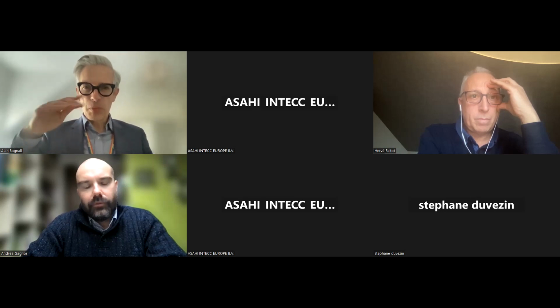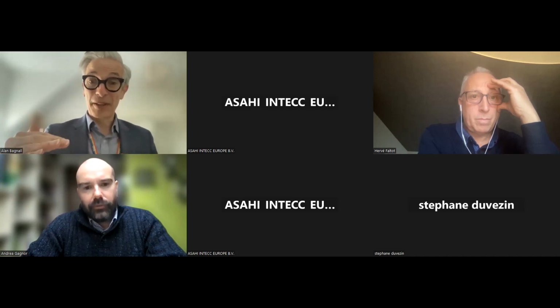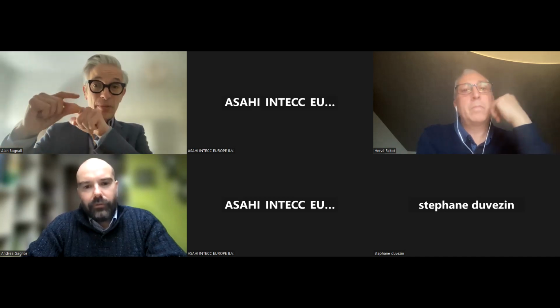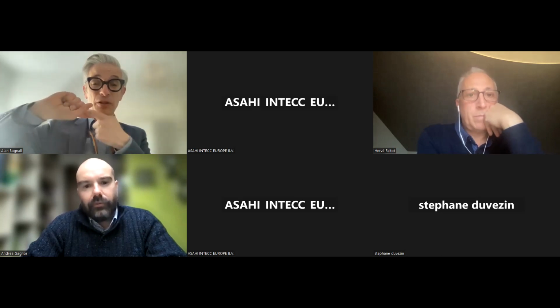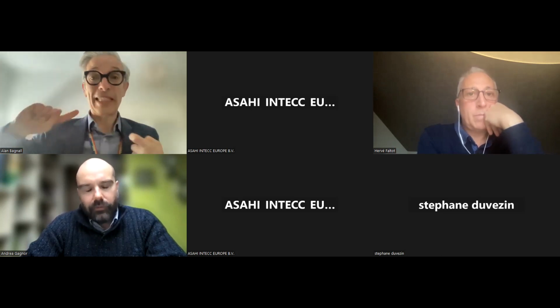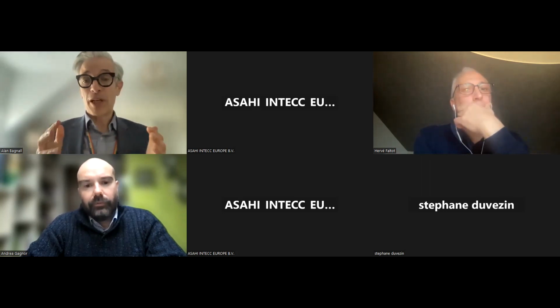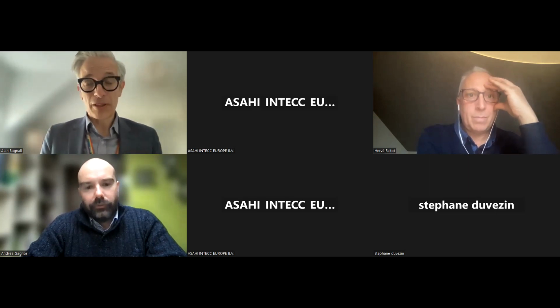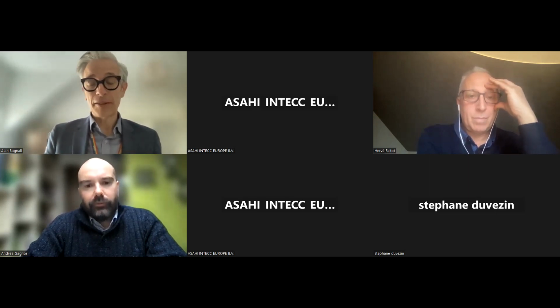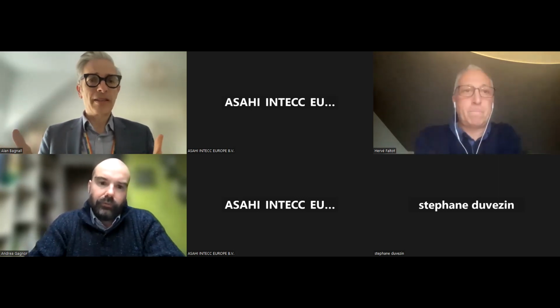And then you just point out to them gently that there's a second camera that's showing it from a completely different angle. And what looks like it's going right down the middle of a vessel in one angle is actually in a different angle going right into the wall, and clearly can't move because it's right up against the wall. So having a go on those types of models is a really great opportunity to try out these different things in practice. You can generally get access to them through your Asahi technicians.